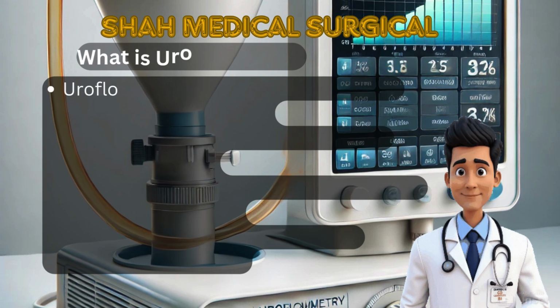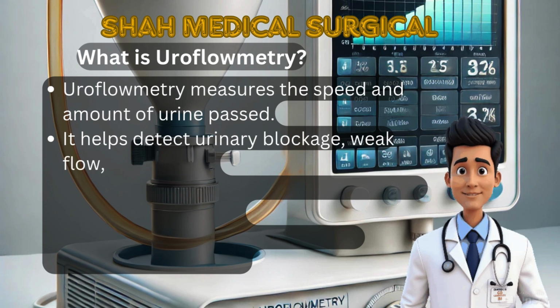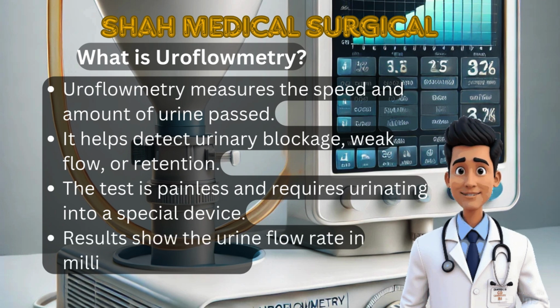What is uroflowmetry? Uroflowmetry measures the speed and amount of urine passed during urination. It helps detect weak flow, urinary retention, or possible obstructions. The test is completely painless, you simply urinate into a specialized device. The results show the urine flow rate in milliliters per second, helping doctors evaluate bladder function.